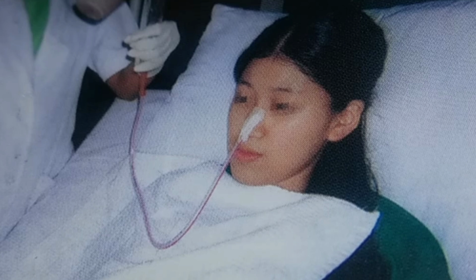And second one is assess for food allergy, time of last feed, bowel movement and laboratory values that we have to check. Assess for the food allergy. If they are taking any vegetables or any food, we have to see whether they are getting any food allergy. Then what time the patient has taken the last food, that also we have to see.